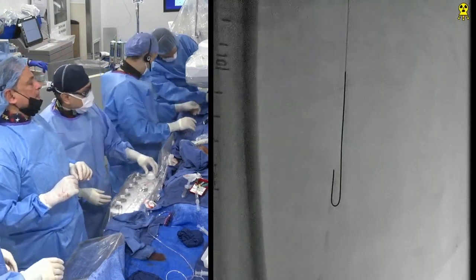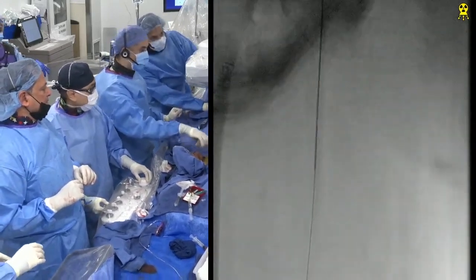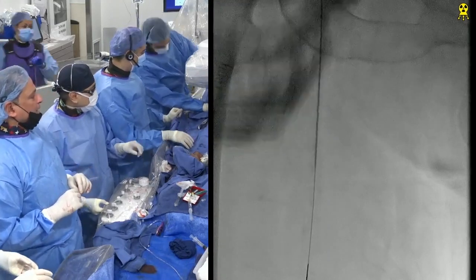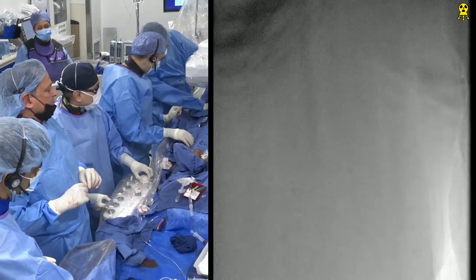Okay. I guess we're doing the whole thing, right? Yeah. Is it reaching? Down. Fantastic. It's there. Is it there in the vessel? I hope it is. Yeah, our micropuncture is in. Yeah, definitely. You sure it's in the vessel? Yeah. I want to make sure it's in the vessel. Okay. All right. Cool. Show me down below. Let me see. Yeah, it's pulsed there.